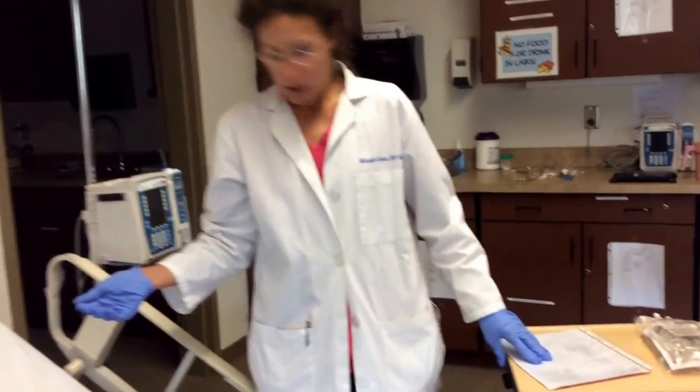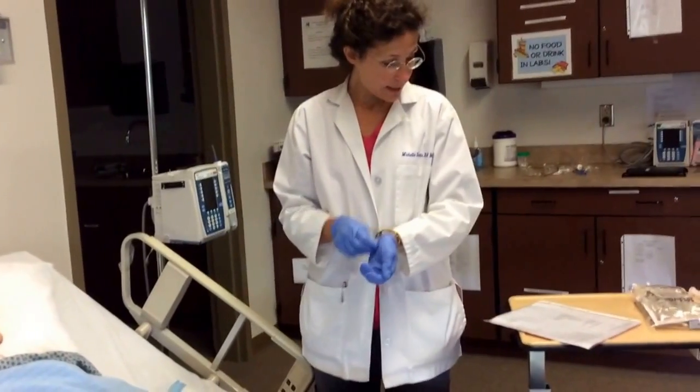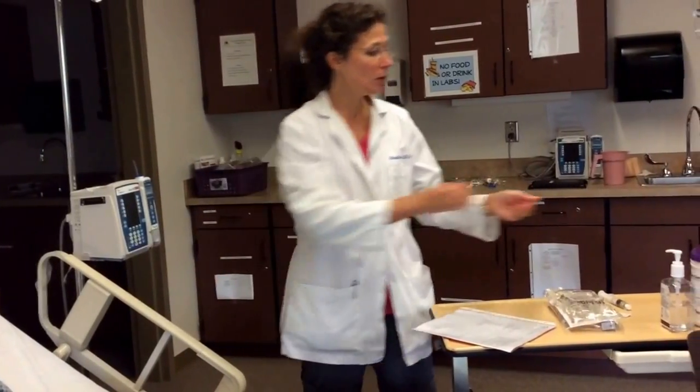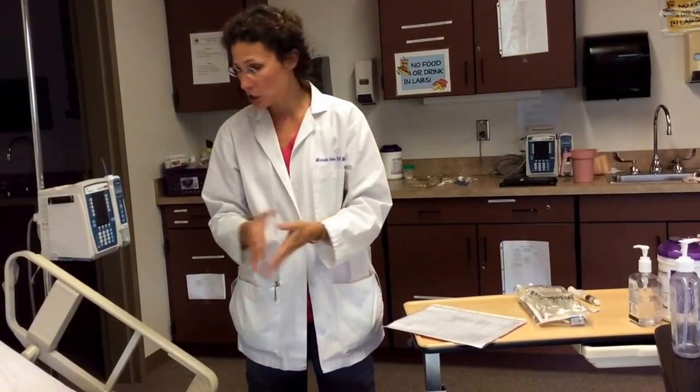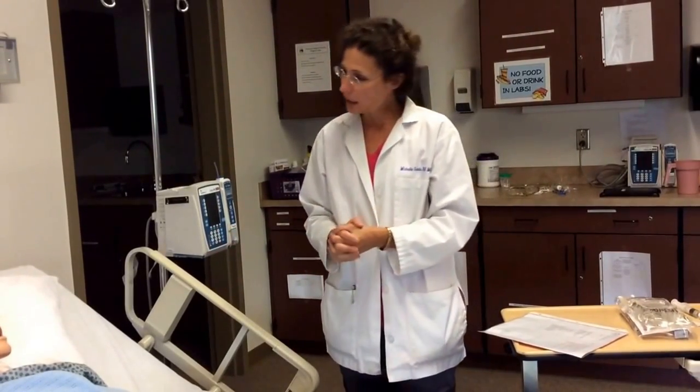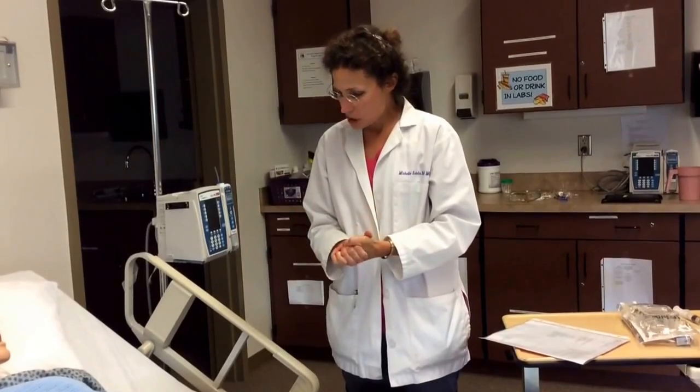Some of the assessment I would complete now: I've looked at labs, I've told you some of his assessment data, and I've also listened to his lungs. I want to know his baseline cardiac and respiratory status, should there be any complications once this blood transfusion is initiated. I'm also checking because I know for the first 15 minutes he's going to be in bed for sure as I'm monitoring, so I would ask him if he needs to use the restroom or anything before we begin. And all of those things check out just fine.